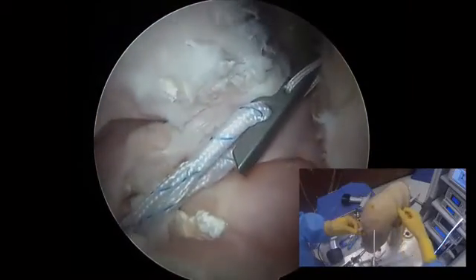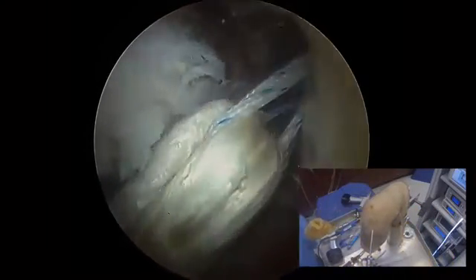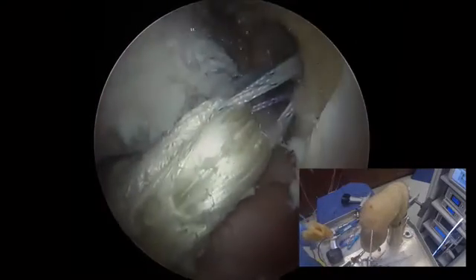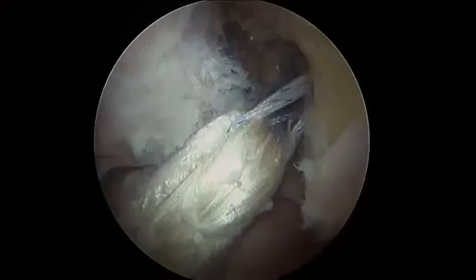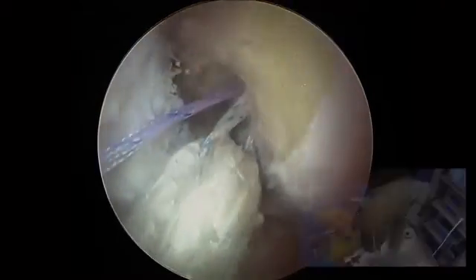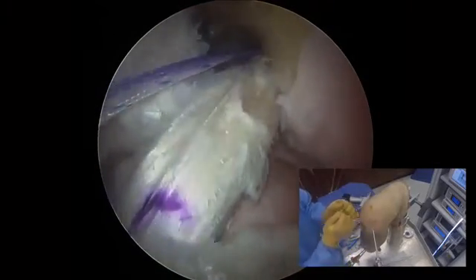Go ahead and pull up. Okay. Good. And snap. And snap. Okay. So the toggle lock is on the lateral cortex. We're going to get the drawstrings for the zip loop. And now we're going to dock the graft into the femoral socket.